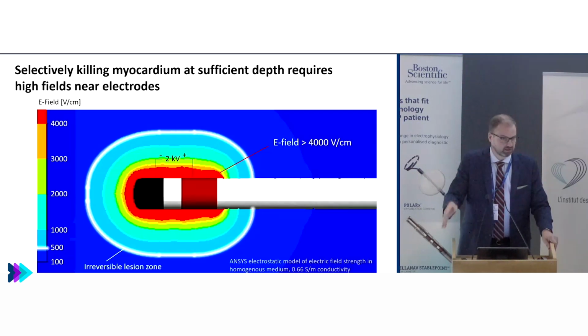So it's not like it's impossible, and certainly 6 months is a long time to deal with something like that. But 1 out of 30,000 is pretty good. There is a transient, let's say 0.4, 0.5% rate of transient phrenic nerve paresis. Why does it happen? Isn't this tissue selective?